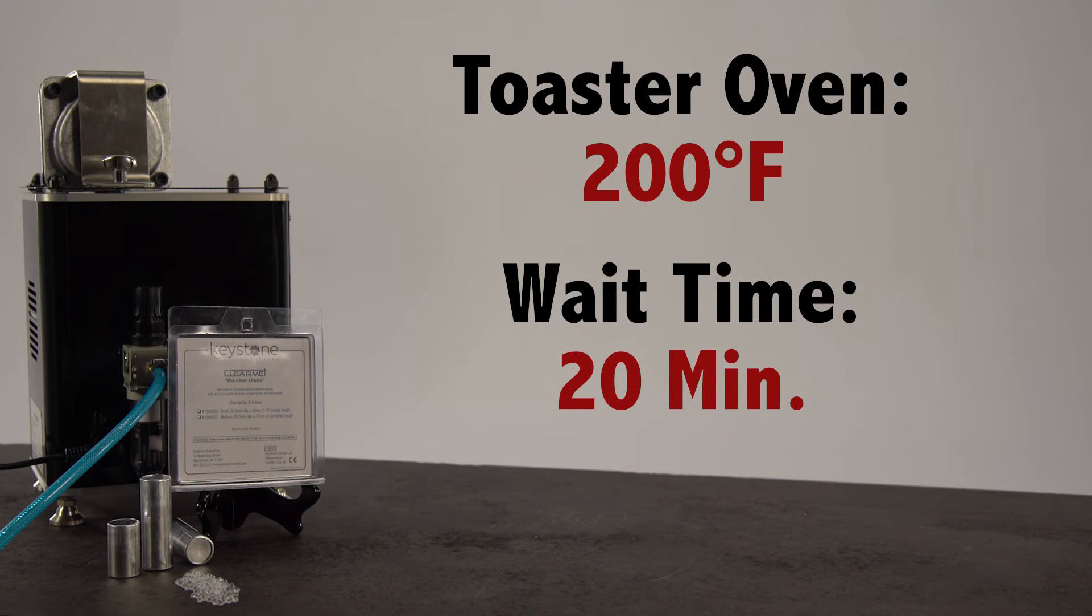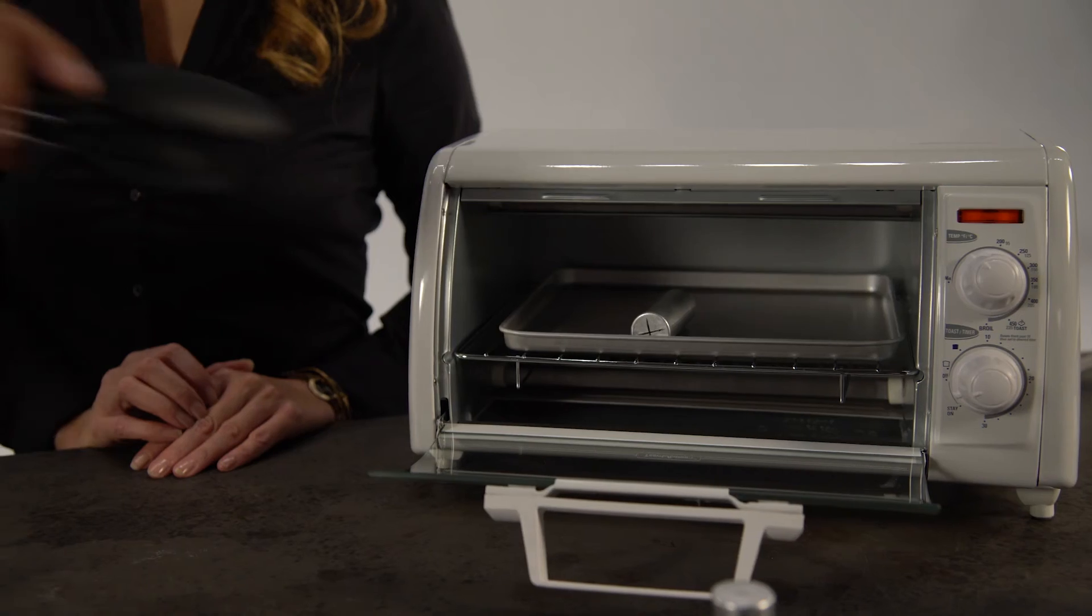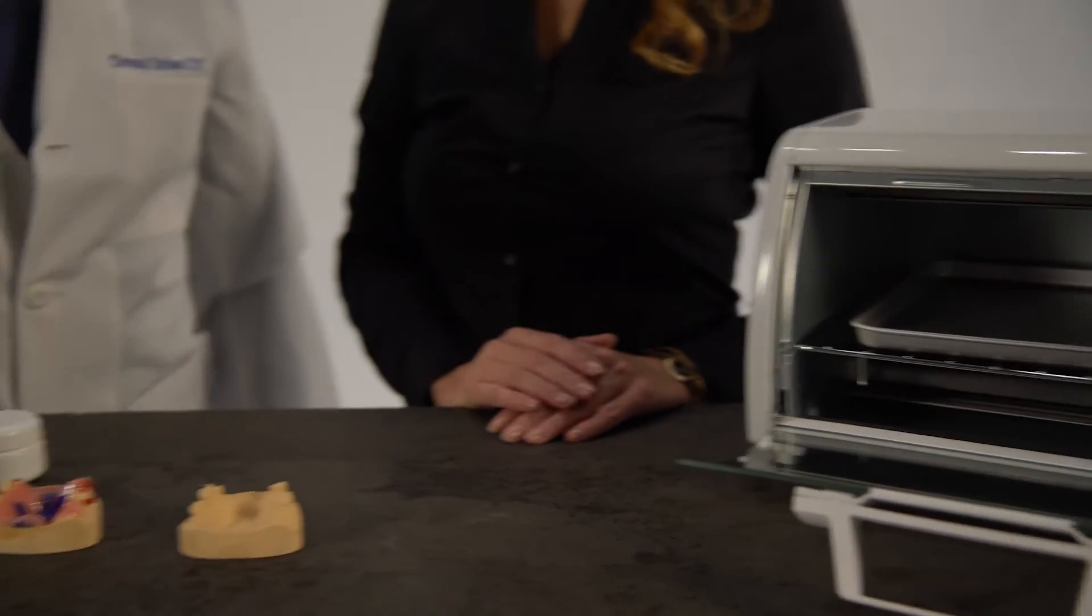The heating of the tube will remove any moisture that the clear mat material may have absorbed. When the alarm goes off on the FlexPress, the clear mat tube is ready to be placed in the injection unit.